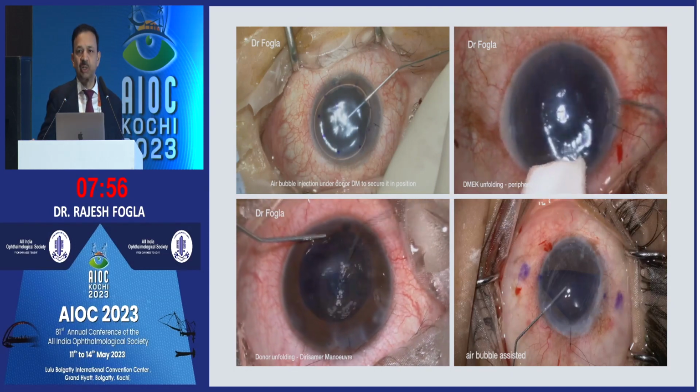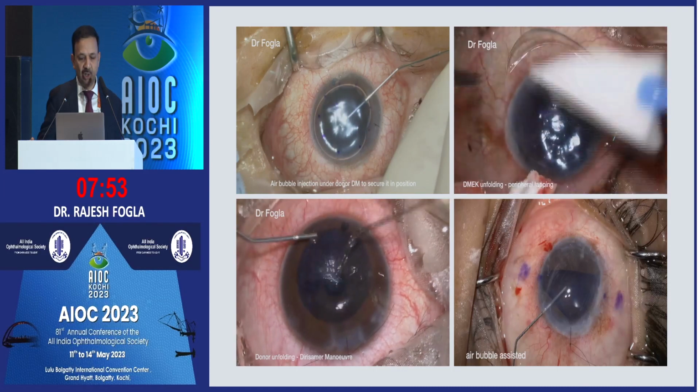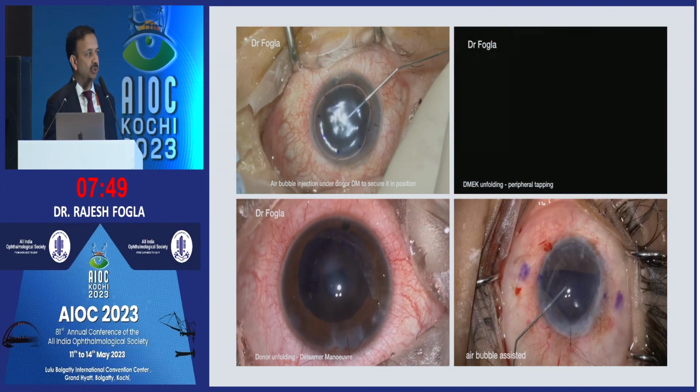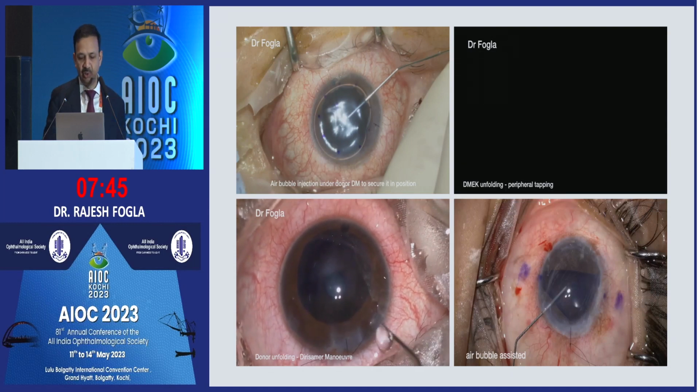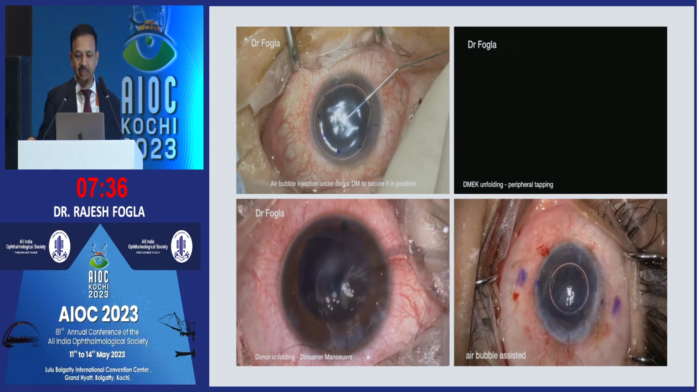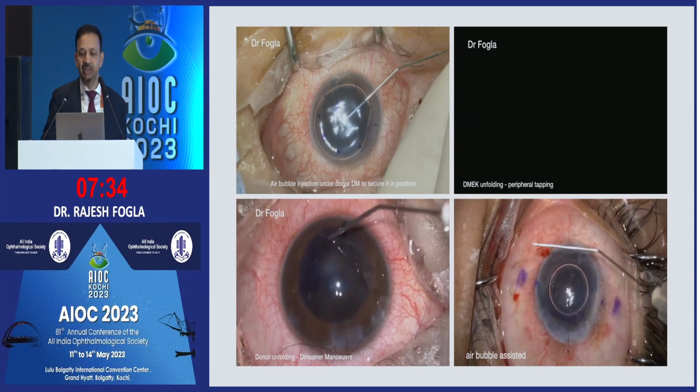Once it's open, you can tap outside the scroll, not over the scroll. And so you don't make the same movements like what you do with a DSEK graft, but you go outside the scroll, and as you tap, you can get the scroll to move. So it basically covers the pupillary area, and then you can go ahead and put your air bubble. If you have a vitrectomized eye or myopic eye with a very deep anterior chamber, sometimes shallowing of the anterior chamber is difficult.